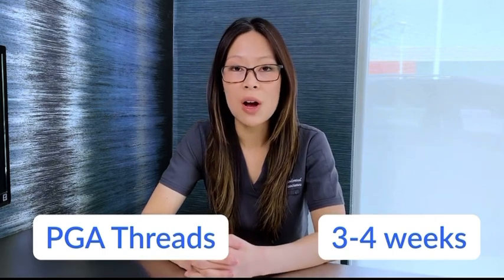PGA is a strong braided material that is used for areas with high muscle pull or for larger procedures where prolonged tension on a wound is required for healing. The limitation is that due to its braided nature, it can wick bacteria into the wound.